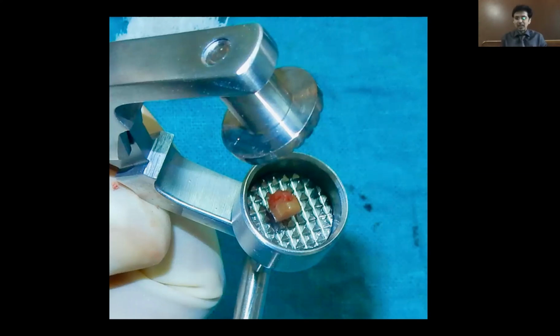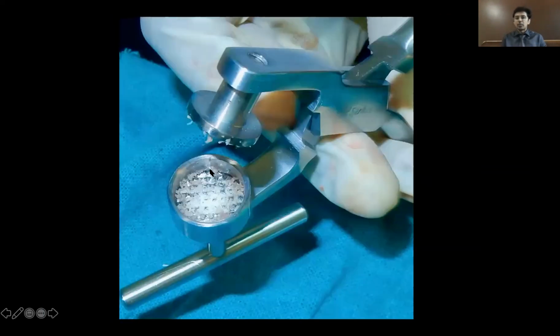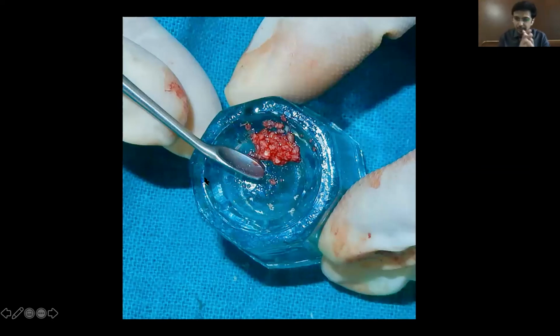So this is the second instrument that you need to buy. This is known as a bone mill or bone crusher. This is 4,500. Once I have crushed it properly, this is how the bone graft particles look. You can mix it with the patient's own blood. It is ready for bone grafting.